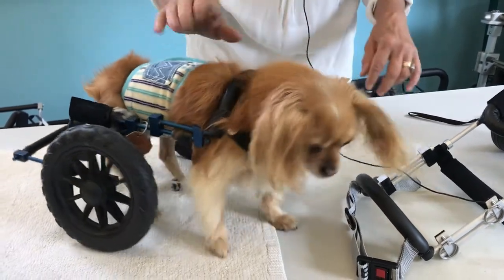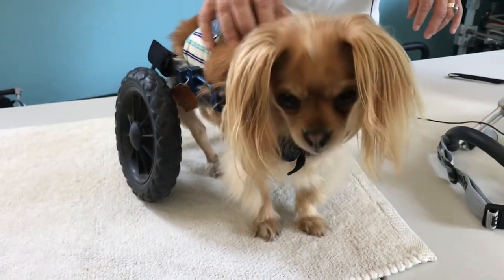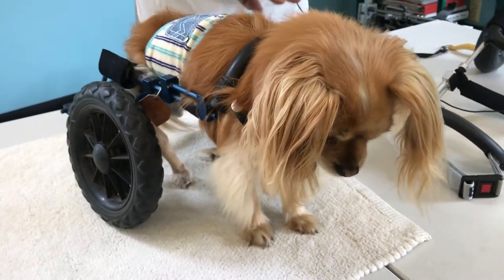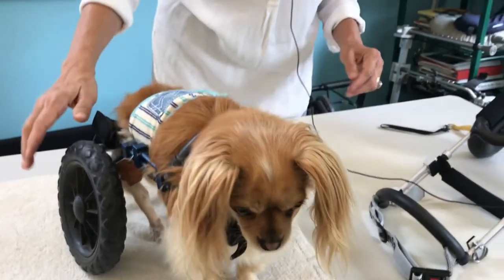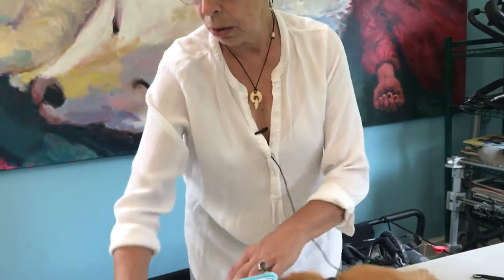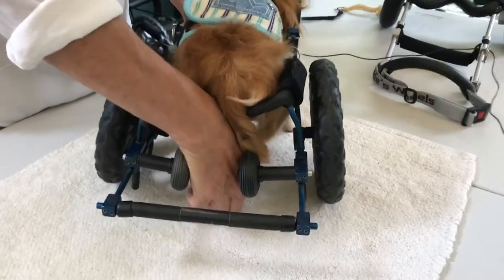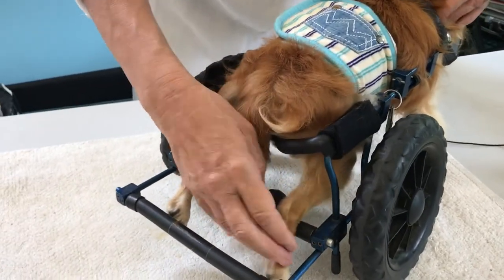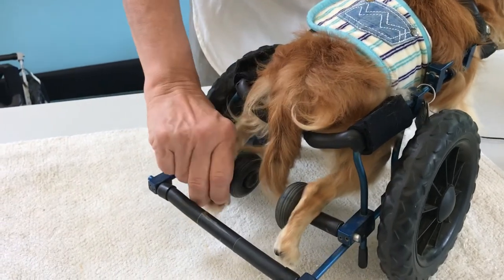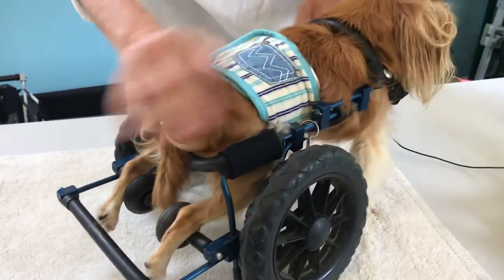This is one of the ways that Eddie's Wheels carts help dogs with IVDD rehabilitate. The whole effect of traction is intrinsic to the cart and we see this time and time again with disc dogs and dogs with broken backs. Finch also has reflexes — you can see him kick. He's got a very strong withdrawal response, but generally he does not use his legs that much, so he has the option of putting his feet in stirrups. With more rehab, we hope to strengthen his legs so that eventually he may become a spinal walker.